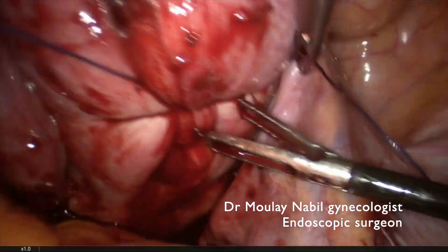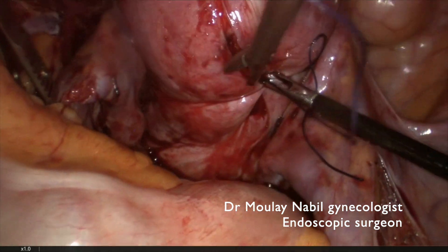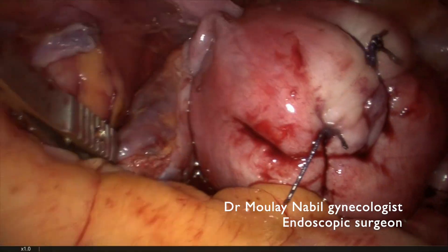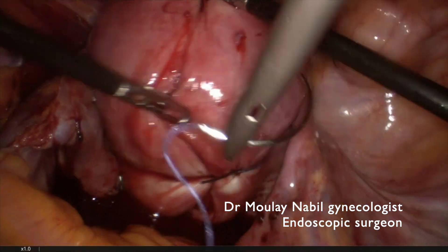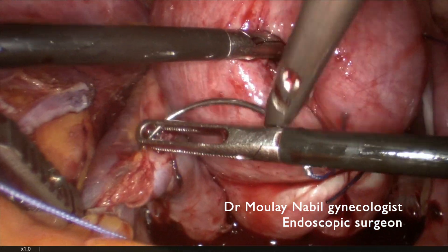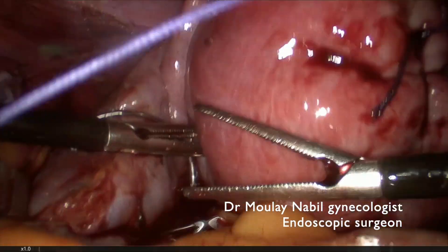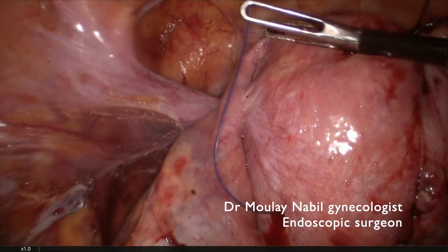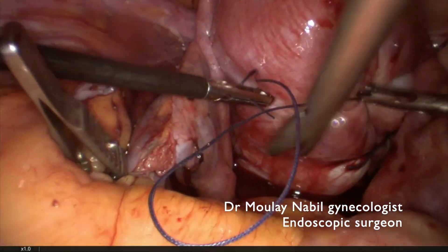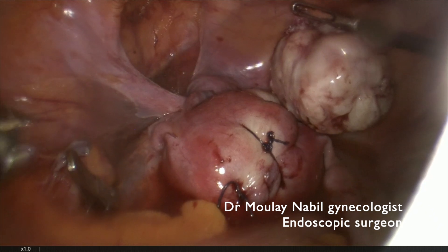We do the closure — the needle is in the opposite position because it's a posterior suture. The assistant invaginates the myoma bed and locks the knot. We complete the closure upward: safe technique, good bites of healthy myometrium. It's important to place your needle in one shot to decrease the capillary bleeding due to multiple needle trauma. The hysterotomy is very well closed.